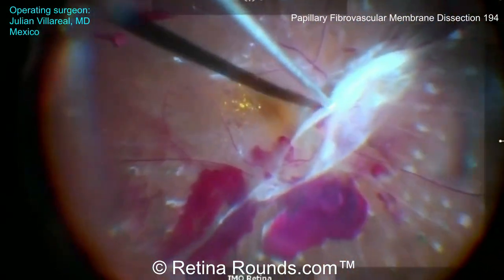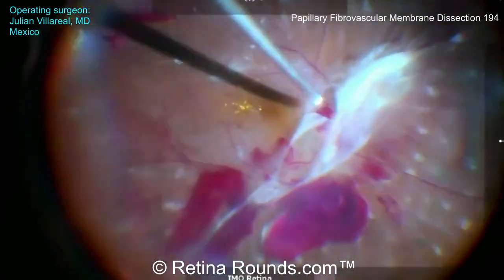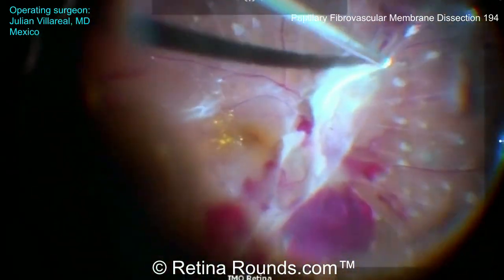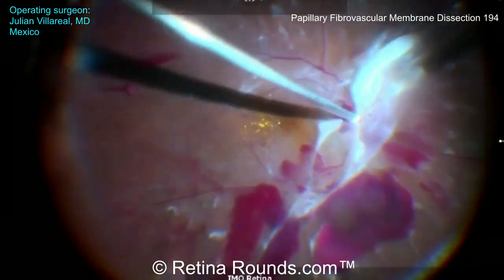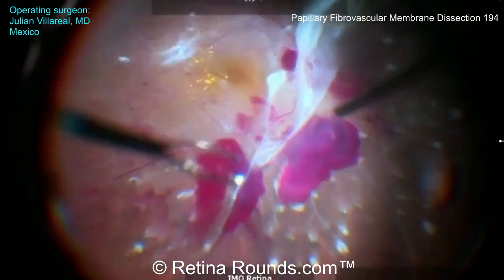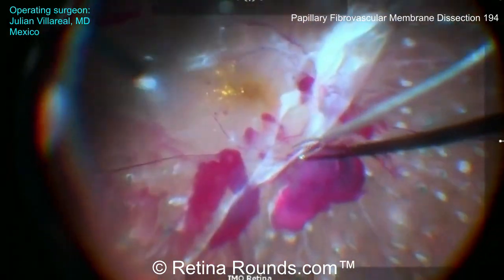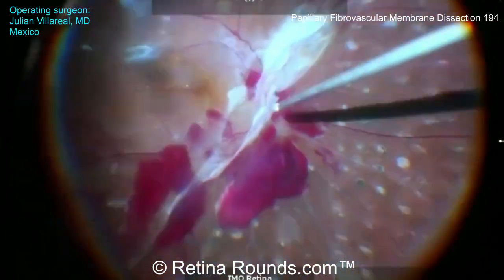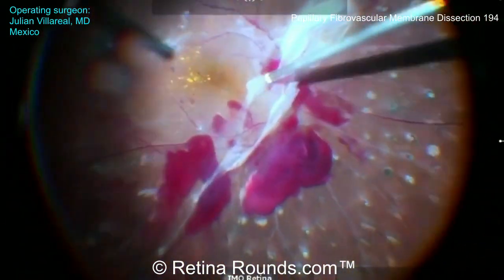Now he's addressing the membrane over the optic nerve, and you can see that it extends along the supratemporal arcade and the infranasal arcade. You can see he's using both hands, combining the forceps at times, but mainly using the cutter. The forceps are being used here to create space and identify the surgical plane, and then the cutter is being used to actually safely engage and remove the tissue.